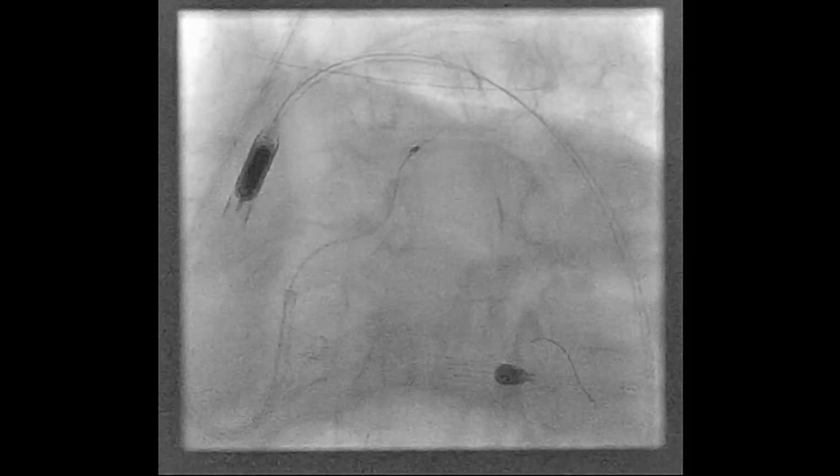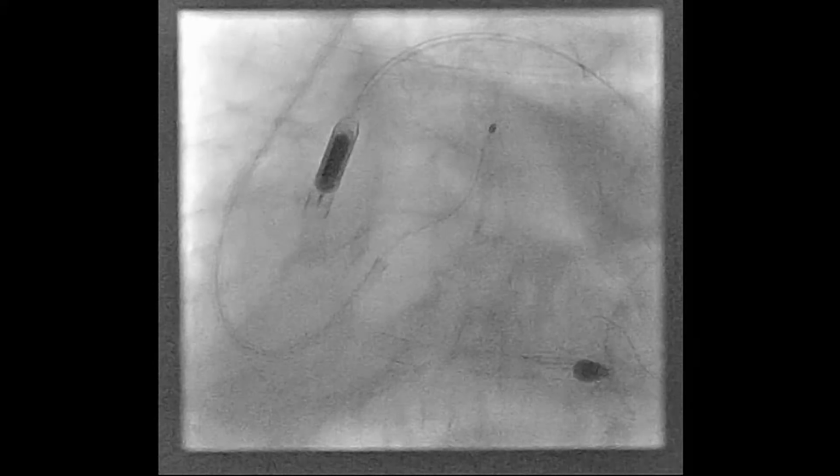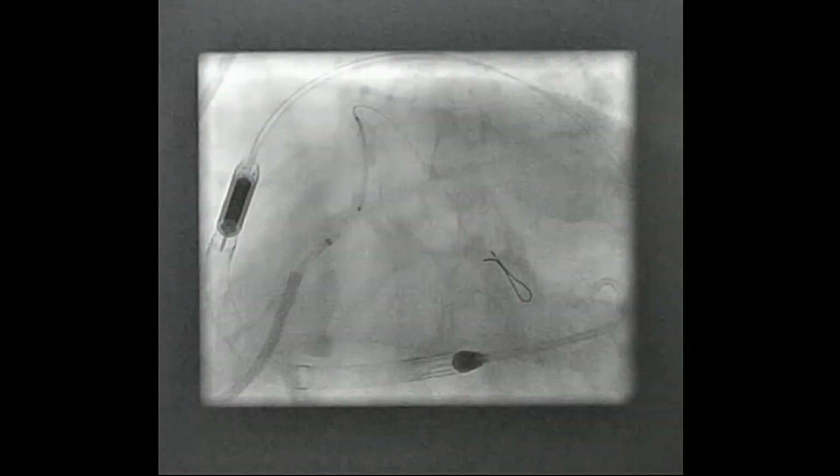I think we have different experiences. Anyway, as you can see, the left main was very tortuous. It took some guts to burr in the left main, but we still did it. And surprisingly, it passed on the first pass. We didn't waste time. We took the 1.5 afterwards. And then the rest was just simple angioplasty.